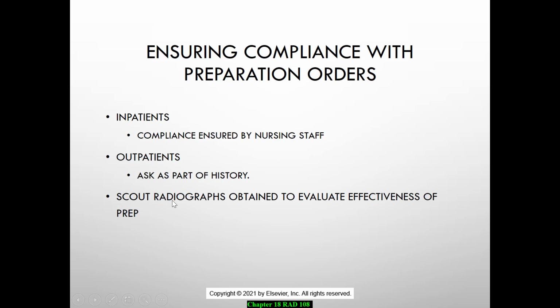Your scout radiographs, so let's say you have somebody that just doesn't know. They're an outpatient, they've come in, they don't know what exams they've had done, because that happens. And you do the scout and you see that, okay, this person didn't follow the prep for the exam. They have a lot of stool. We're not going to be able to see what we need to see on this lower GI. So then you'll need to reschedule that exam after they've had a cleansing. Inpatients, again, they're a little easier because you can send them back up to the unit. They can do the enema to clear them out, and then they can bring them back down to the department. But these outpatients, it becomes a little bit more of a concern and a hassle for them.